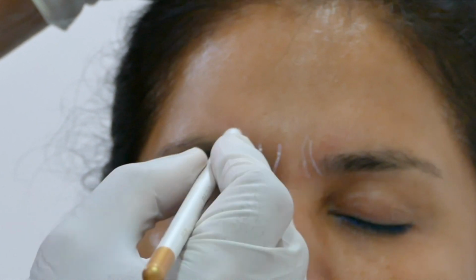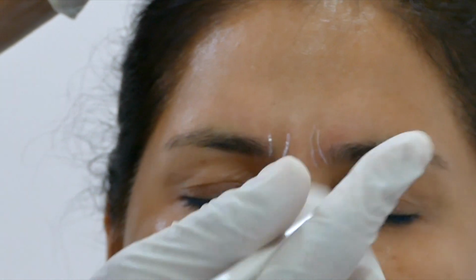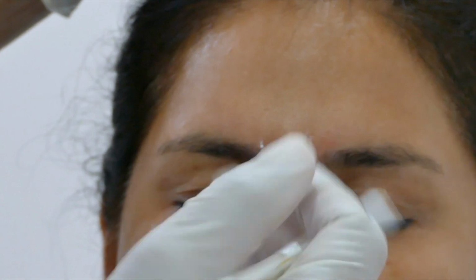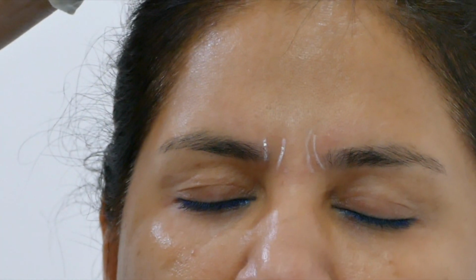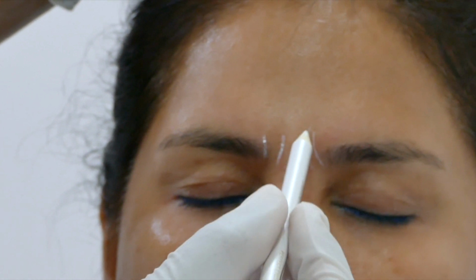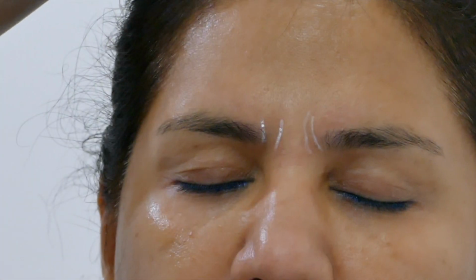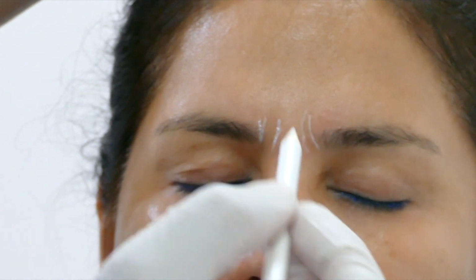Now only Botox injection, if you give, it will reduce the dynamic line, but this line will persist. So what happens is the use of Botox becomes more and needs more frequently, because once the Botox starts weaning off, it starts showing very quickly. So if you combine a little bit of filler with a little bit of Botox, the effect of Botox will stay much longer. So I will show you how these areas are injected.